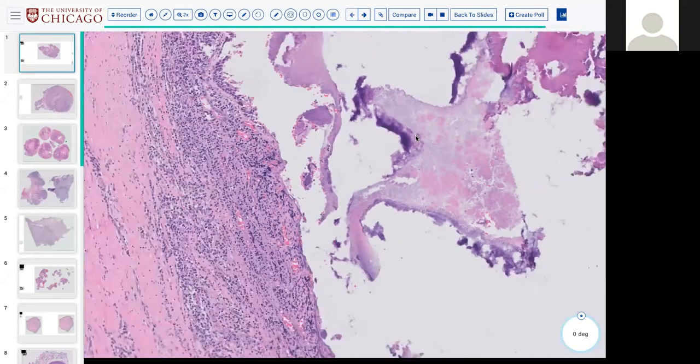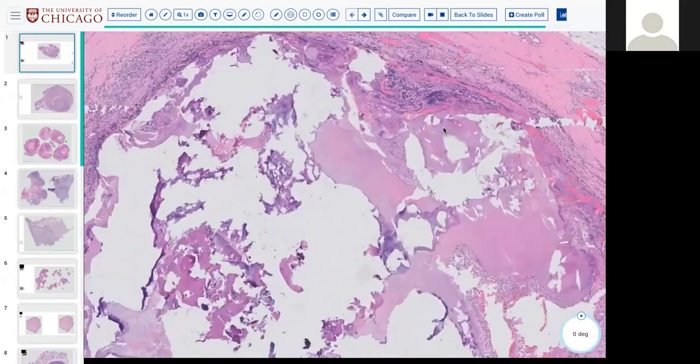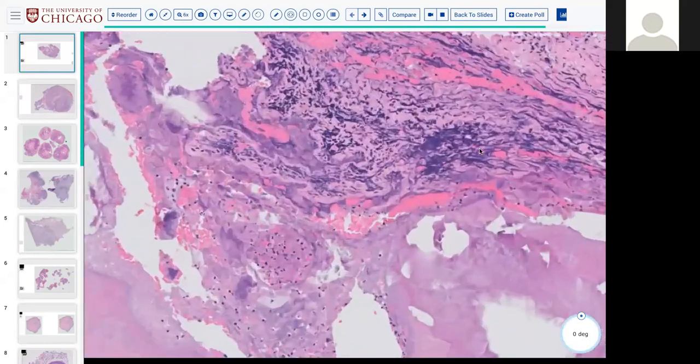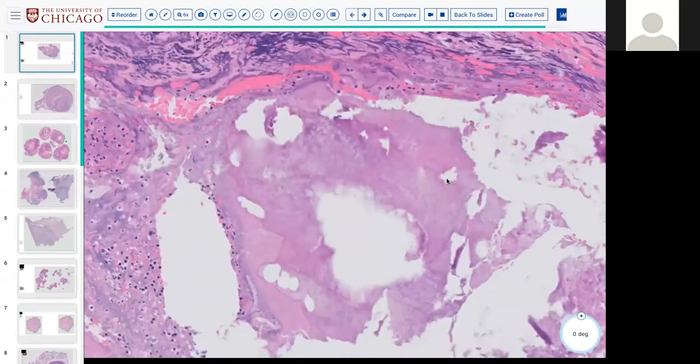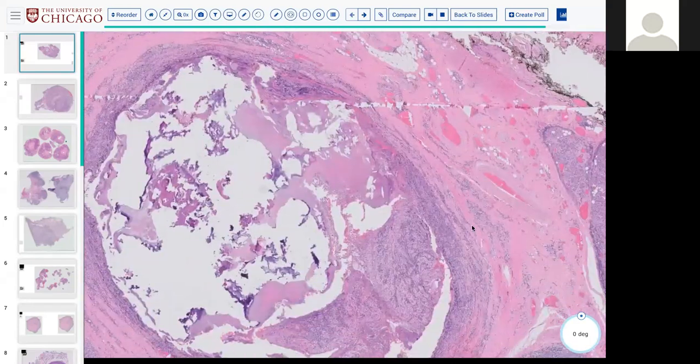So I'm not convinced we're dealing with a neoplastic process here, given the background of inflammation. You'd think about, what's the word, sialadenitis or necrotizing sialometaplasia, that sort of thing.